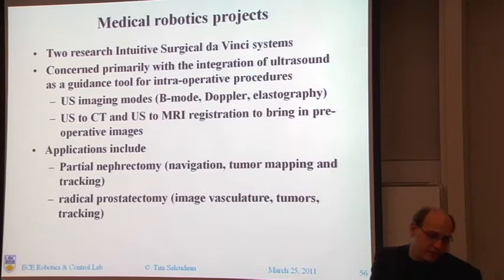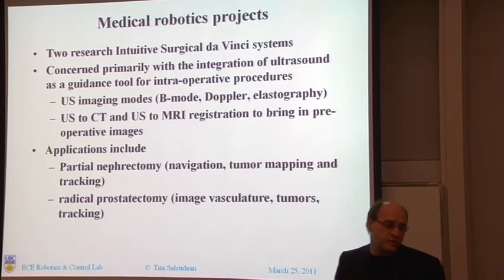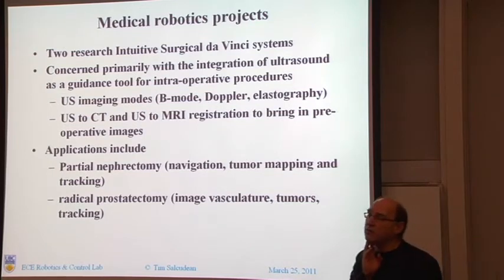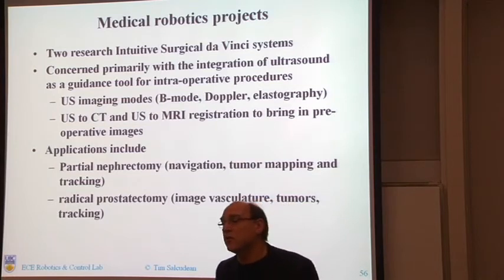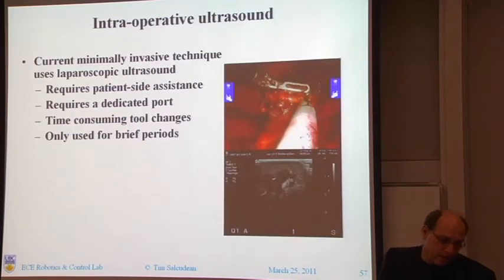We have 2 research robots with APIs that we purchased from Intuitive in December. And we're primarily concerned with the integration of ultrasound as a guidance tool for intraoperative procedures. We want to do ultrasound both for its intrinsic use, and we also want to use ultrasound in order to bring preoperative images into the OR. And we're looking at kidney surgery and prostate surgery for this.